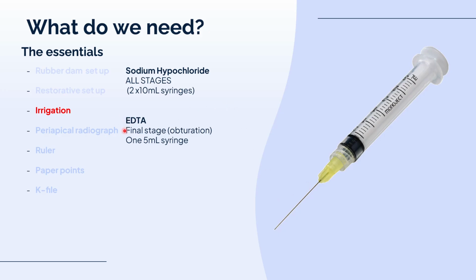EDTA, I only use on the final stage, and I don't use much of it. I just need a 5 ml syringe. Okay.